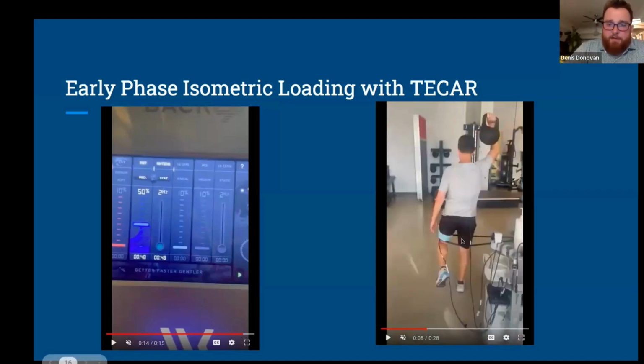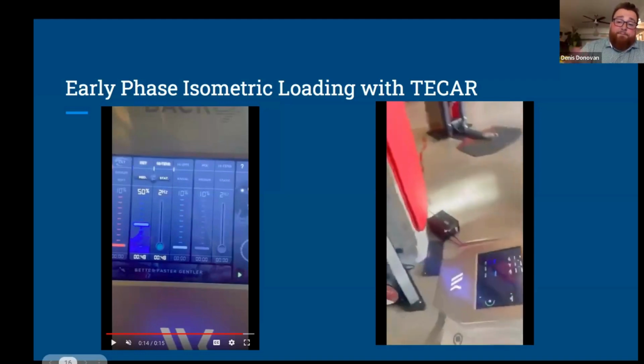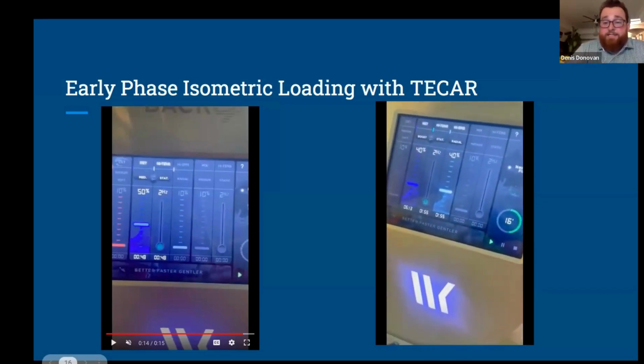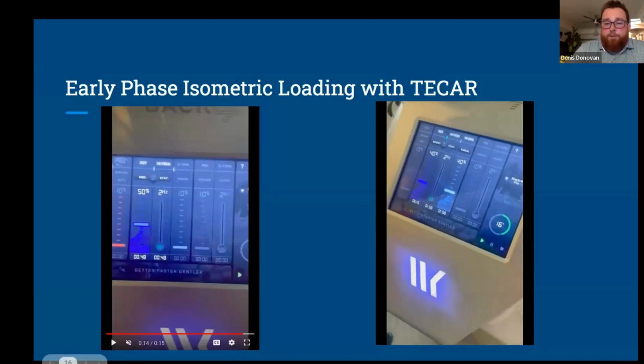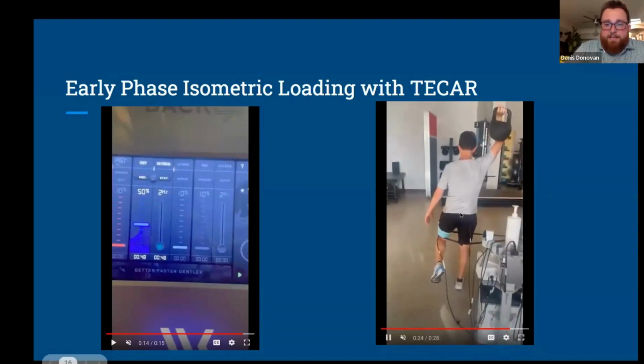So let me back that up again. I have right here the applicator right over that SI lumbosacral junction. The ground is just distal to the gluteal fold. This is a gentleman who is having more SI joint pain. So again, really like this exercise for creating some lumbopelvic stability. Getting the Tecar running at the same time as we're doing it really helped decrease his discomfort with that movement. We then progress to more higher level rotational work, but that's the idea there.